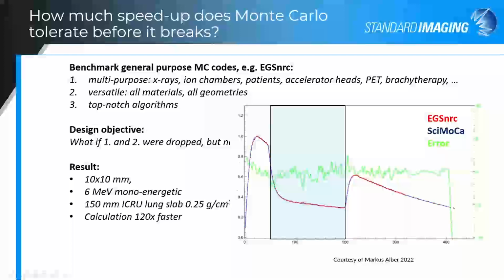And so this is a standard benchmark case that you've probably seen if you've been to many Monte Carlo talks.